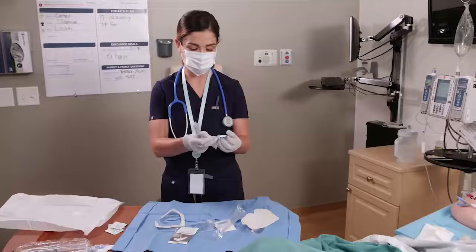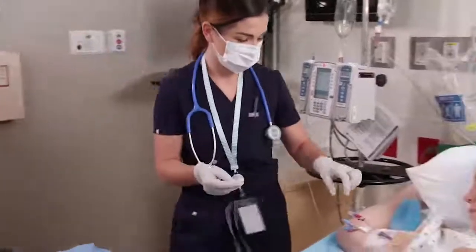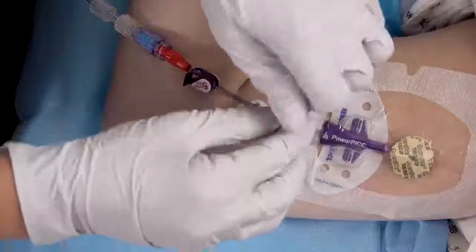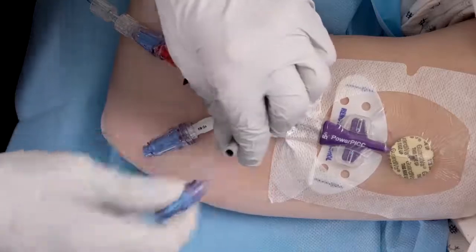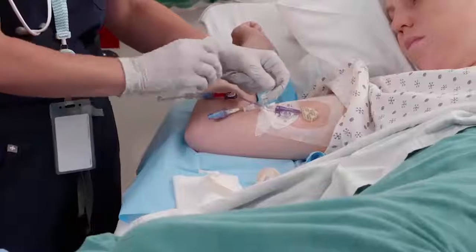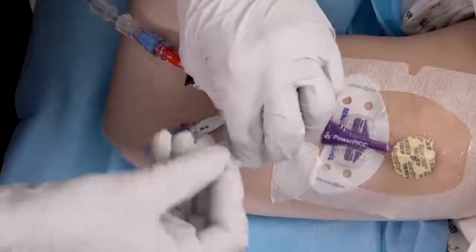Prepare the needle-free connector per manufacturer's instructions. Prior to removing the existing needle-free connector, cleanse the junction and then clamp extension tubing and remove the needle-free connector. Take care to not let the open extension end come in contact with items, and then scrub the extension tubing hub with alcohol wipe for at least 15 seconds.